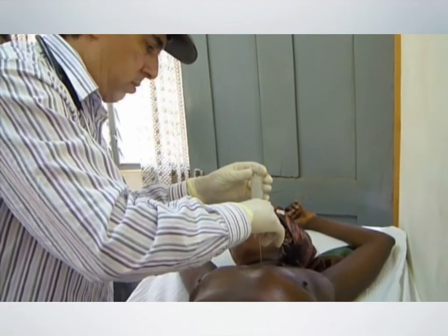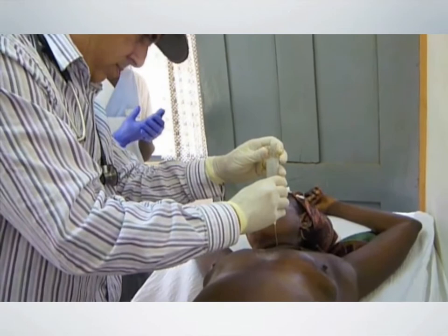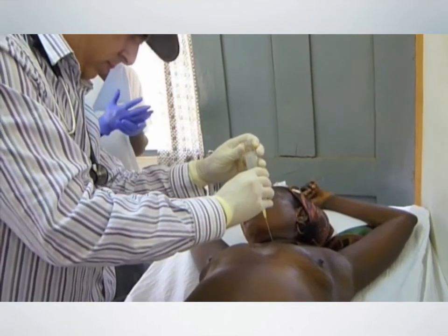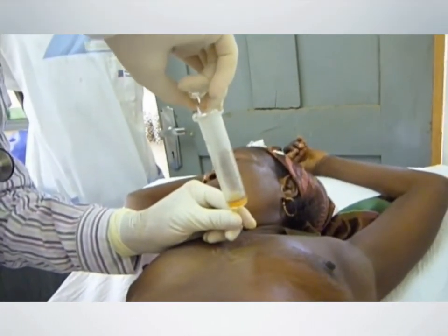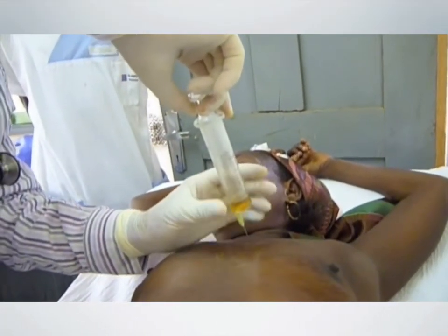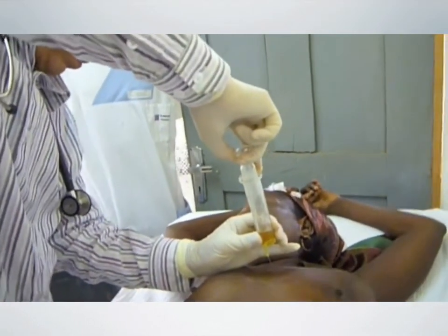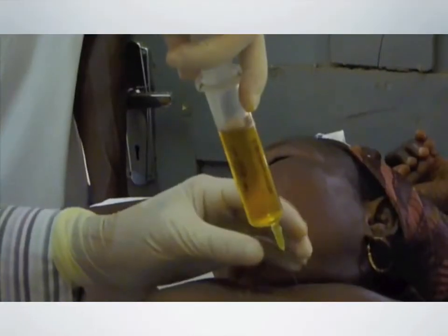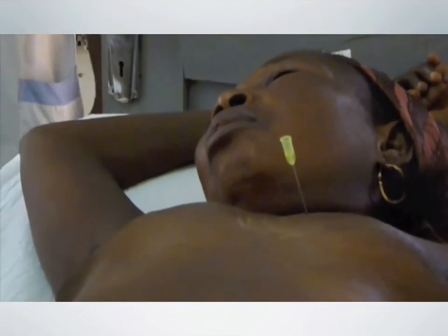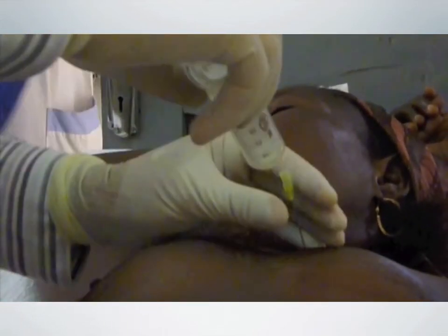And here I am performing the parasternal approach on this patient. It's important to note that this is in a very rural community, and the patient has no sedation, no xylocaine because it's not available, and in fact doesn't even have local anesthesia, but she's not in any pain whatsoever. The heart is quite superficial, and you can even see the needle bobbing next to the heart because you're in the pericardium and the pressure is being transmitted.